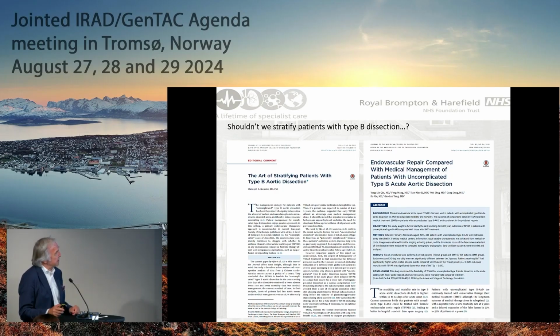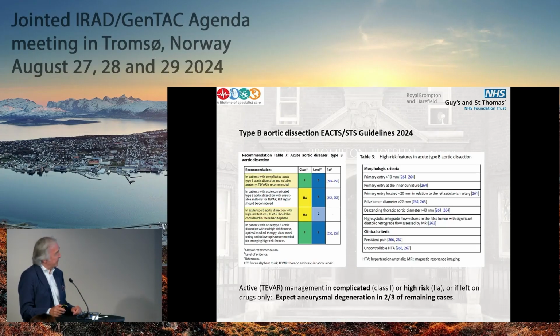And this was on the heels of a publication in JACC 8 years ago from China, a big group of patients that underwent unselected endovascular treatment. My voice was basically for stratification. The means of stratification is something we are still discussing, partially here. Who is a patient suitable for an endovascular approach to benefit from it, not only to do it, but to benefit the patient?